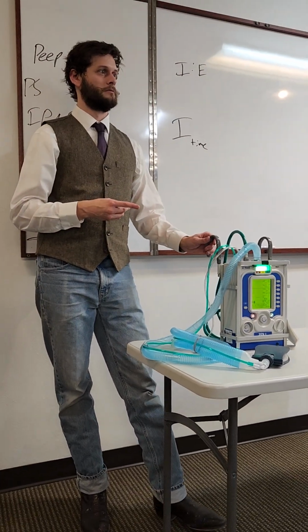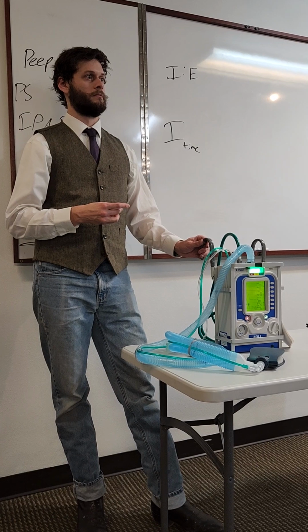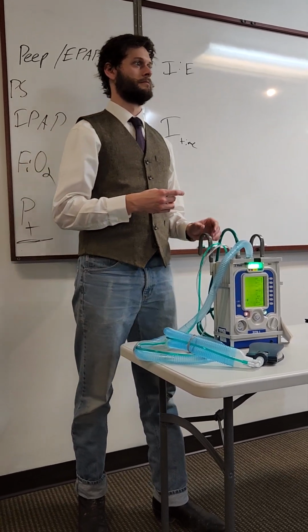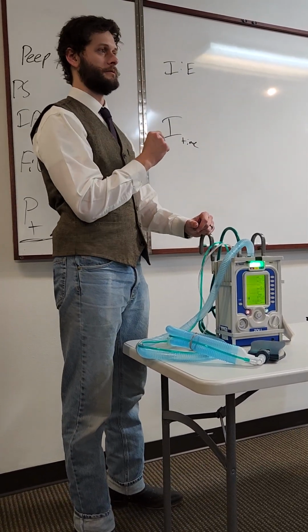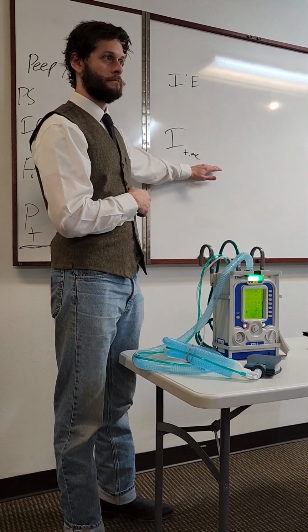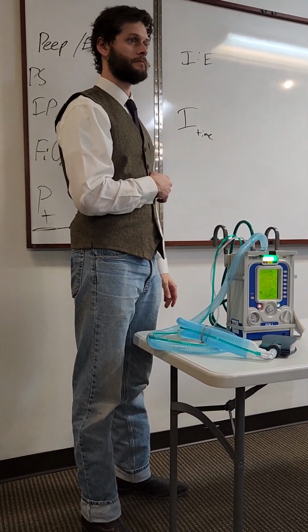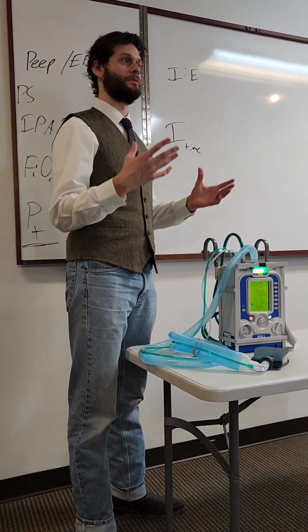Yeah. So when you do change it from the IE to the I time, does it automatically change the alarm? Like you don't have to individually change the alarm values to I time as well? The alarms are breaths per minute. Okay. So it just is based on whatever calculation, because the ventilator is regulating the I time. The patient can't regulate that. That's up to the ventilator. Got it. Cool. So that's kind of where it comes into. And it's breaths per minute.